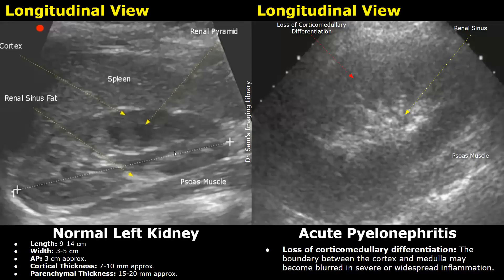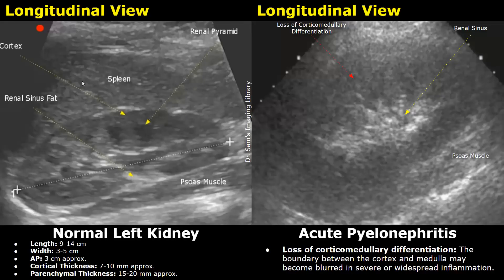This is a normal left kidney. We can see the outer cortex clearly and the inner medulla clearly as well. The central hyperechoic structure is the renal sinus, which appears hyperechoic because of fat. The striated structure is the psoas muscle, and up here is the spleen. This is in longitudinal view. The normal length of the kidney is between 9 and 14 centimeters.